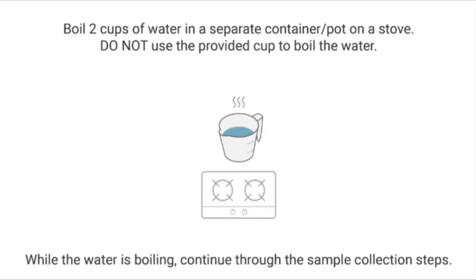Boil two cups of water in a separate container or in a pot on a stove. Do not use the provided cup to boil the water. While the water is boiling, begin the test.